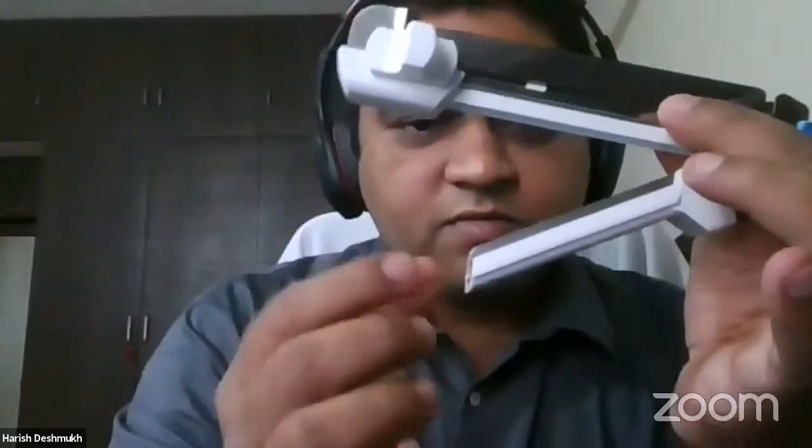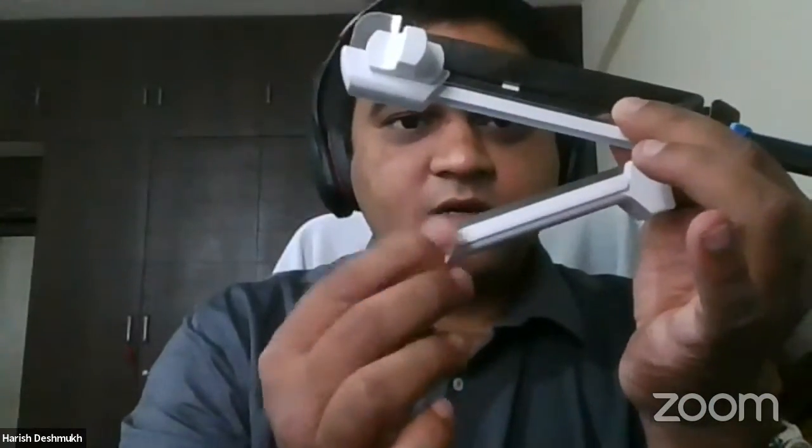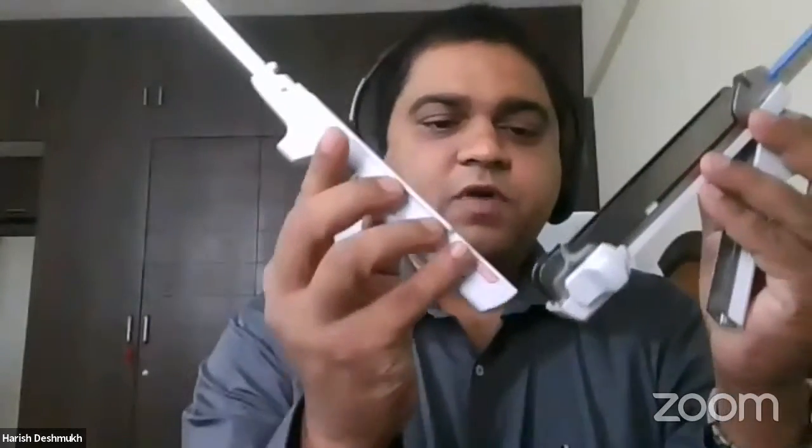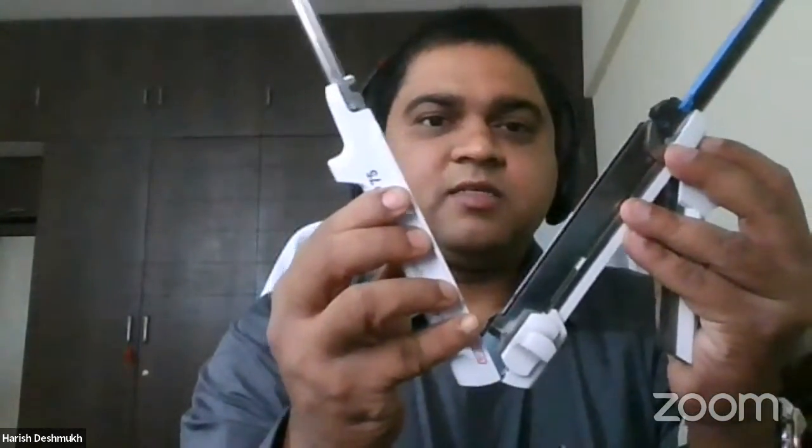You have a firing trigger, which is the closing trigger, kept here. It should always be open when you are loading the cartridge. After loading the cartridge, you have the anvil half, the other half. While aligning the two ends, most of the time surgeons try to align it between the handle here, which requires time. The easiest way to align the two ends is to align at the proximal end like this and drop it, and it will come back automatically at the closing.